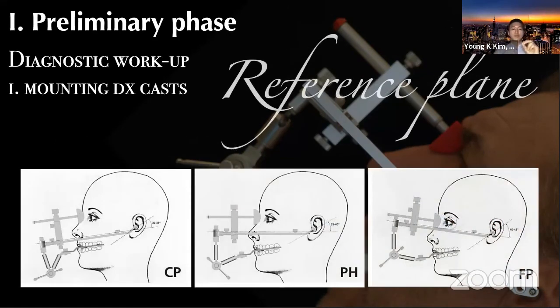And looking at the reference planes, depending on the articulator and the Facebow systems, you're utilizing different planes of occlusion, the reference plane. So why are we interested in this? Later you will see the consequences of using different Facebows and articulators in reference to the space that we will have on our mounted cast.